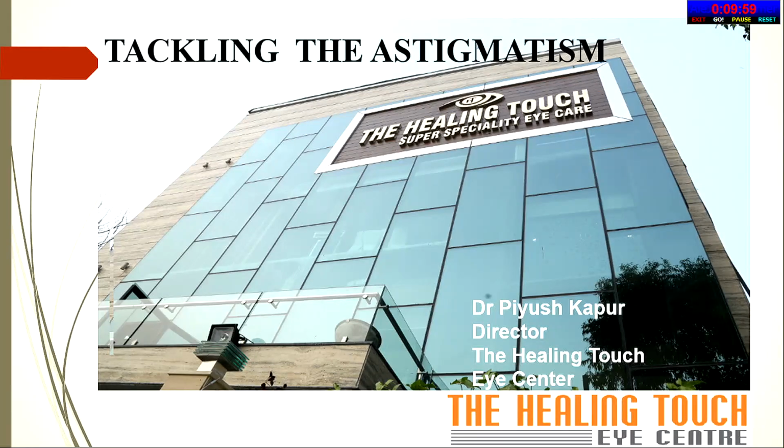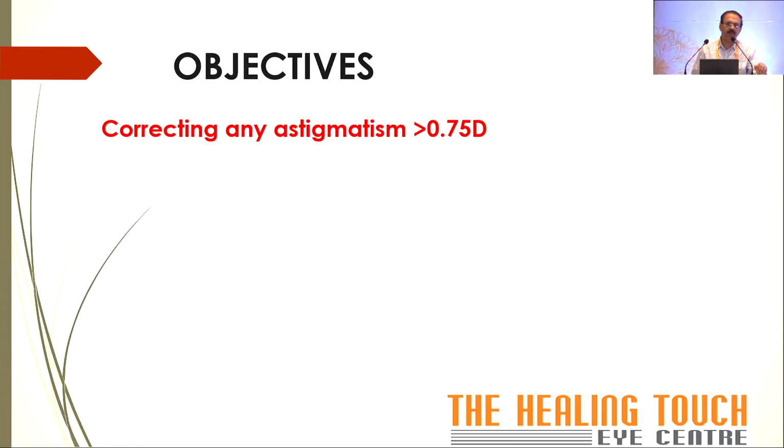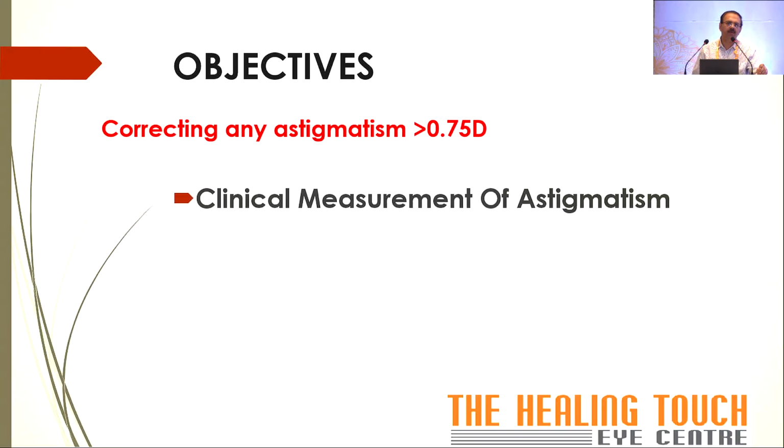So as we talk about the precision, we are going towards a target 2020. The whole idea is to be very precise in our surgery, targeting the astigmatism and neutralizing the pre-existing astigmatism to anything less than 0.75 theoretically, but practically what I always target is less than about 0.5, or a bang on emmetropia, because all said and done, slight errors may remain due to various reasons.